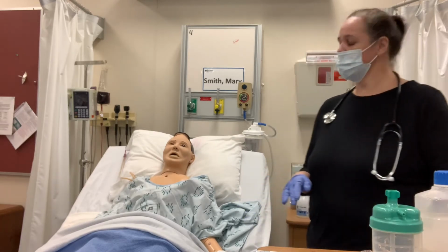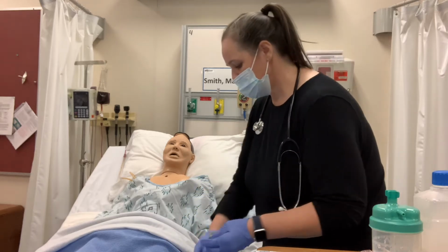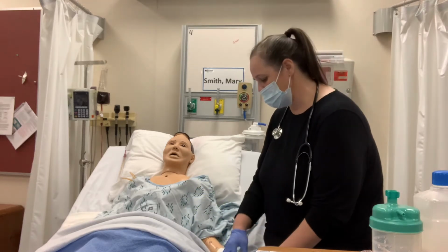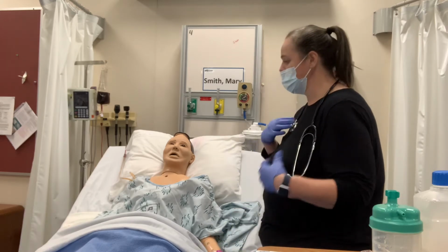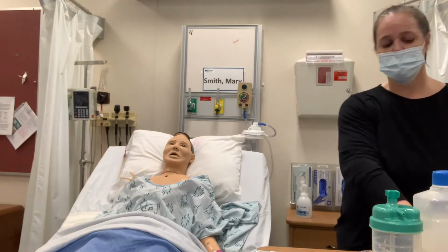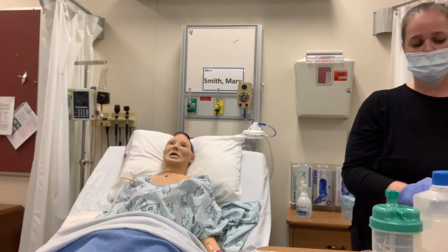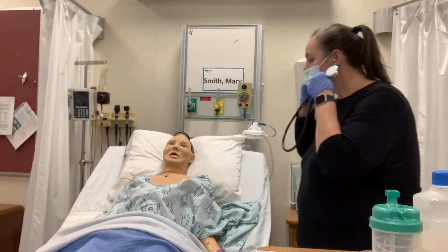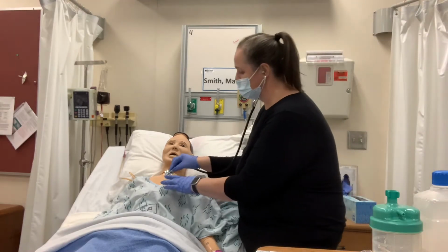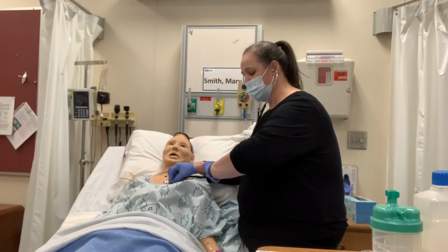Okay, I'd like to do a quick respiratory assessment as well to see how you're doing. So I'm going to do some vital signs and do a pulse oximetry. So I'll put this on your finger here. And then if it's okay with you, I'd like to put my stethoscope on your chest and listen to your heart and listen to your breathing. Is that okay? Okay, so let me do this. Just going to put my stethoscope right here on your chest. And you can just breathe like normal. I'm going to listen to your heart first.